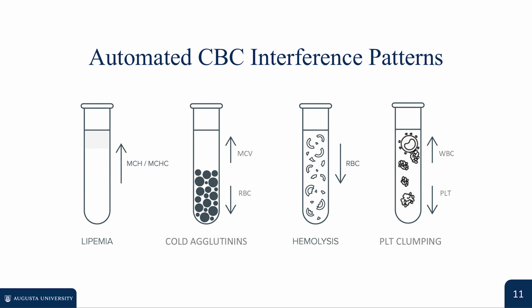Platelet clumping and EDTA-induced satellitism cause platelets to aggregate or adhere to neutrophils. This drops the measured platelet count while falsely elevating the WBC count, as large platelet clumps exceed the leukocyte sizing threshold of 35 femtoliters and enter the white blood cell counting bath.